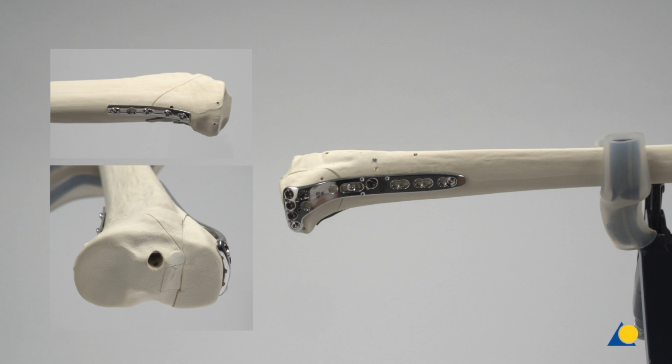Screw insertion into the second plate row is optional and depends on the fracture location and geometry. In the case that there are unused plate head holes, screw placement must be equally distributed between the proximal and second row of the plate. Depending on the plate length and bone quality, either cortical or locking screws can be used to complete distal plate fixation.